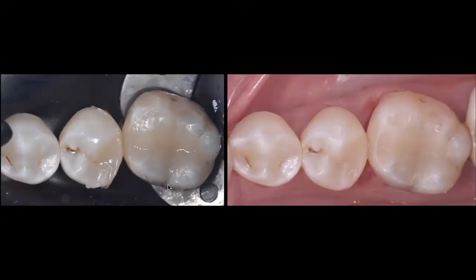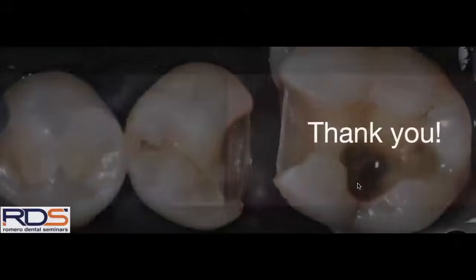So then all we have to do is remove all the excess, make sure that we polish, that we check the tightness of our contact, that we adjust occlusion, and then finish and polish our restoration and send our patient home. I hope that these very nice and well described clinical tips help you in your everyday practice.